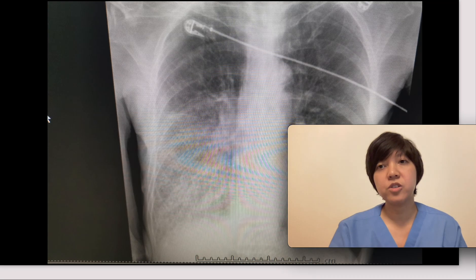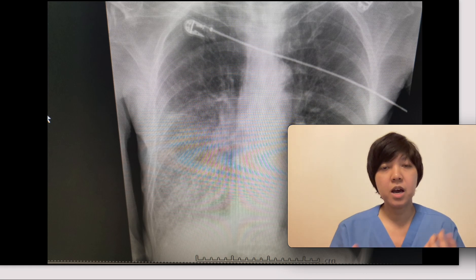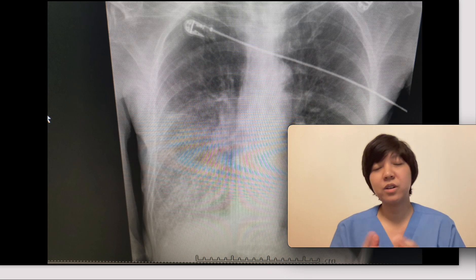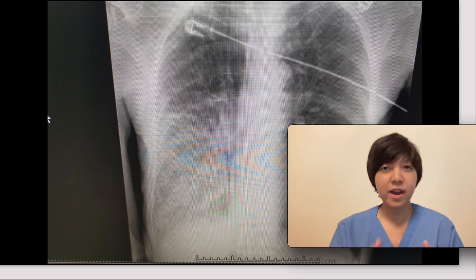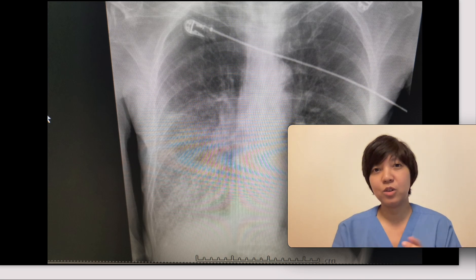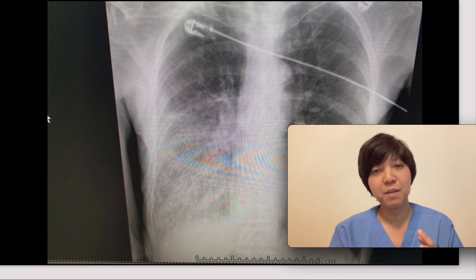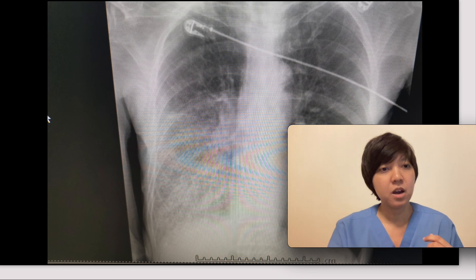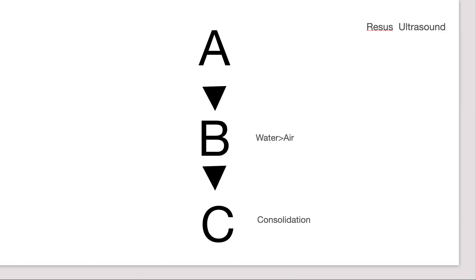This is a real patient who came in with dyspnea, and on the right side you can see he has consolidation. If you don't have time to do an X-ray first and want to see if it's heart failure or pneumonia, you can easily assess not only for B-lines but also for any consolidation. The pattern is: A-lines mean air more than water; B-lines mean water more than air; C-lines mean there is probably consolidation.